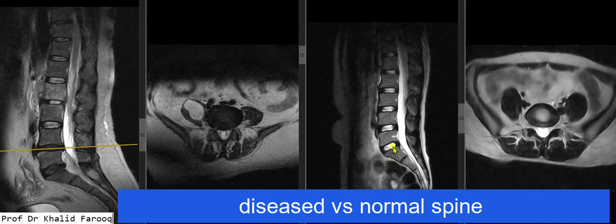Here we can see there is normal alignment of the lumbosacral spine and all vertebrae show normal marrow signals. In this case, however, there is an area of marrow abnormality in the L2 vertebra, while the remaining vertebrae show normal marrow signals.